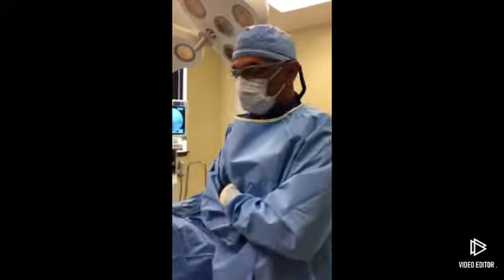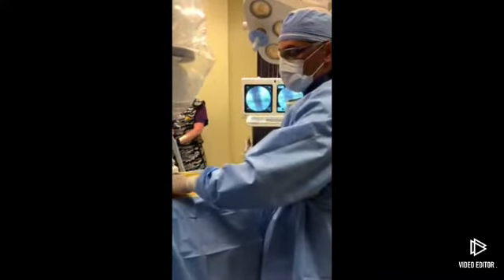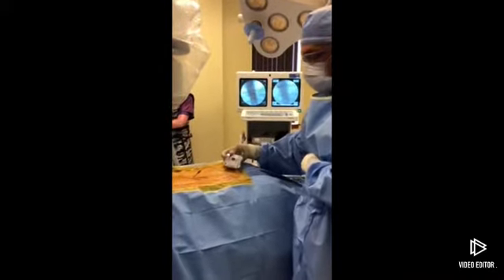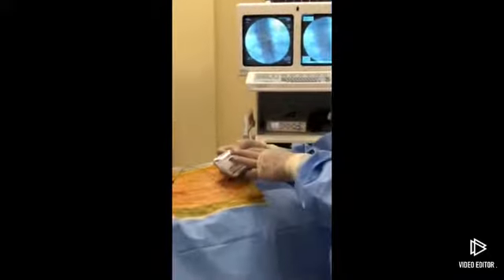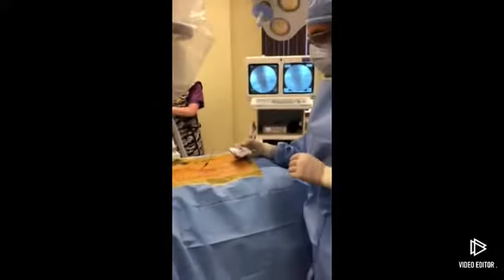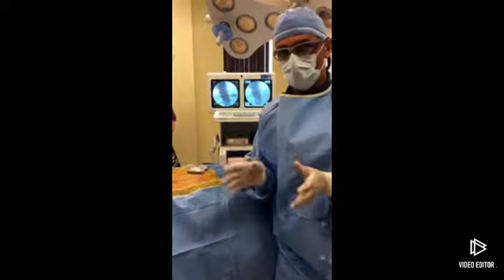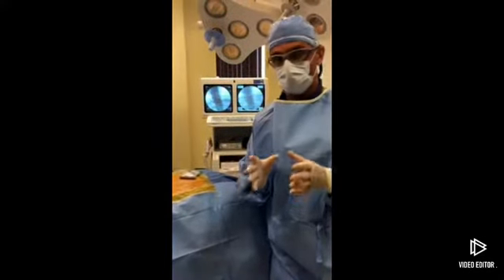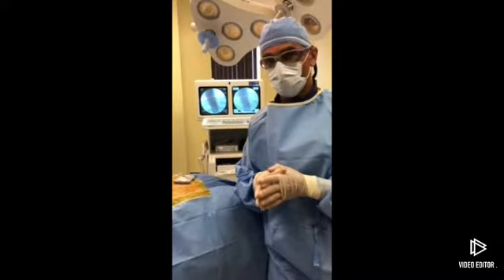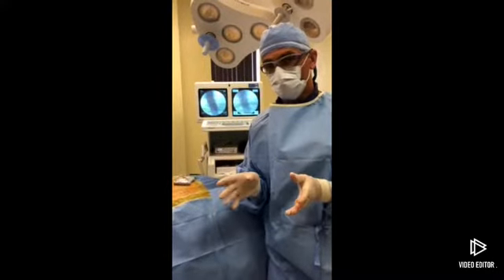Okay guys, so what we've done is we've placed the spinal cord electrode through the Tuohy needle, and it's residing up about here behind the T9 vertebral body. The folks from the Medtronic company have used wireless Bluetooth technology to remotely stimulate this device with electrical current from across the room, and the patient has felt paresthesia, or pins and needles, on the left side of her body, including the left low back, buttock, and leg, which is where she has her pain. It can sometimes be difficult during these treatments to get the patients to feel and perceive the stimulation where you want, but we were able to achieve that today.